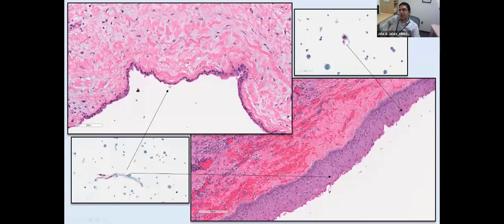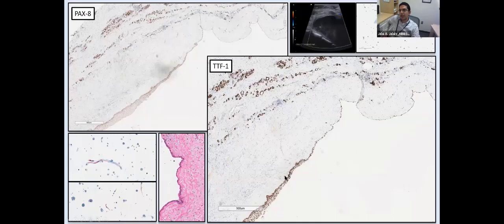And looking closer at these cells, they certainly explain the cytological findings of the aspirate, where we can see some thin and flattened squamous cells and some plumper squamous cells, but overall it is maturing quite nicely throughout. So we did a workup for this case, and indeed they are staining with PAX8 and TTF1, which indicates that they are derived from follicular cells. So basically this is just squamous metaplasia of follicular cells involving a thyroid nodule that became cystic, and there's no evidence of malignancy or neoplasia.